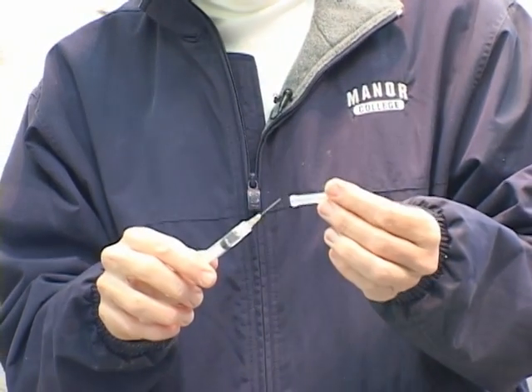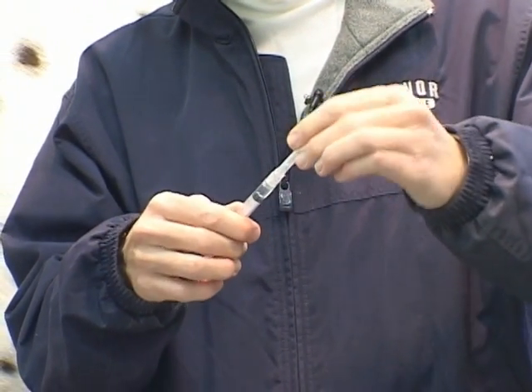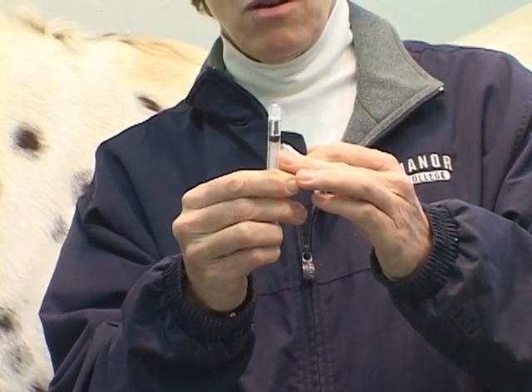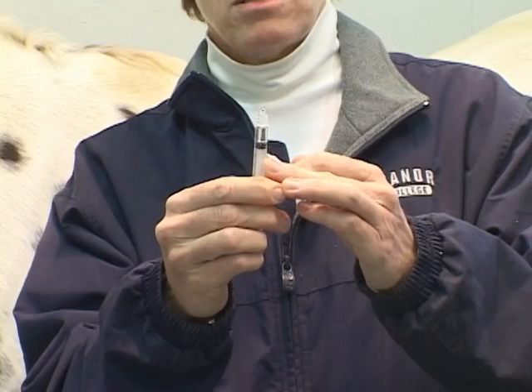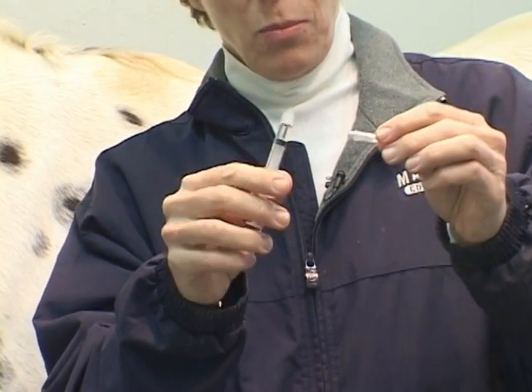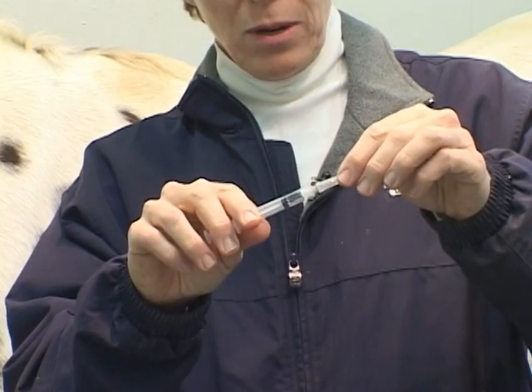Now I'm going to remove my needle from my syringe and bring myself up to a proper meniscus. You see on TV how they're always squirting the stuff up and obsessing about their meniscus — in reality, if you get the bubbles out, that's good, but you don't have to make yourself crazy.